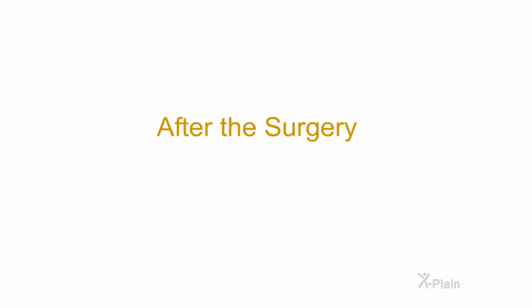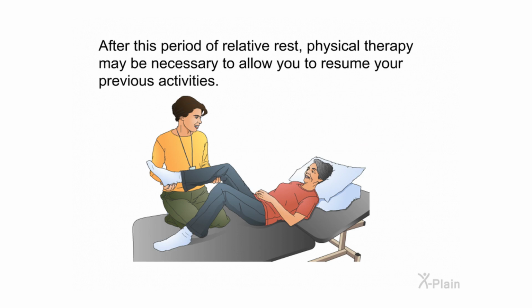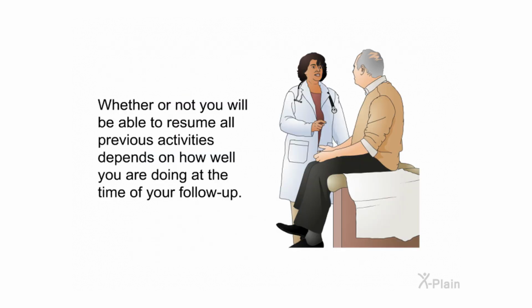After the surgery, no repetitive bending or twisting or heavy lifting is allowed in the few weeks following the operation. After this period of relative rest, physical therapy may be necessary to allow you to resume your previous activities. Whether or not you will be able to resume all previous activities depends on how well you are doing at the time of your follow-up.